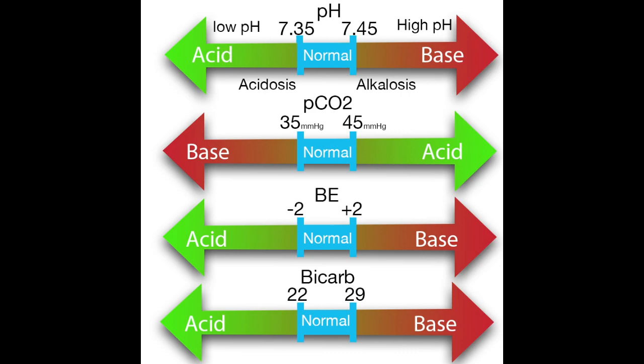And again, work out if the metabolic system is trying to cause acidosis or alkalosis. You then need to see which system is dominant. Usually one system will be dominant with the other one trying to compensate. Sometimes both the systems will be trying to push in the same direction and will be contributing to the same derangement, in which case the patient's said to have a mixed acidosis or a mixed alkalosis, depending on which way they're going.